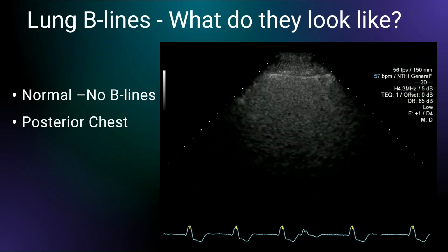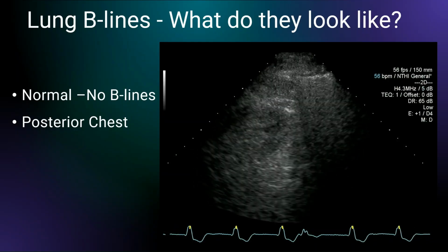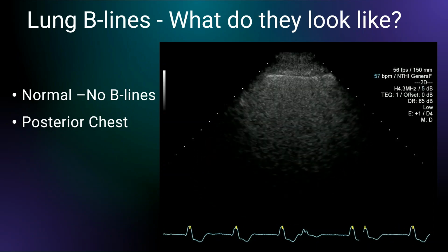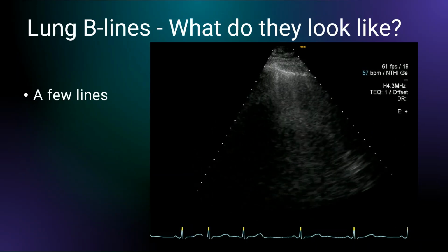This one's actually looking from the back though. You can see the lung field cross over the diaphragm more or less in the relative middle of the picture just here, and lung and organ down below there. But again, no sign of B lines.